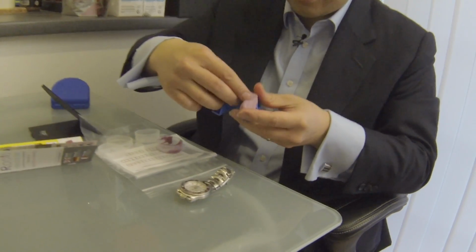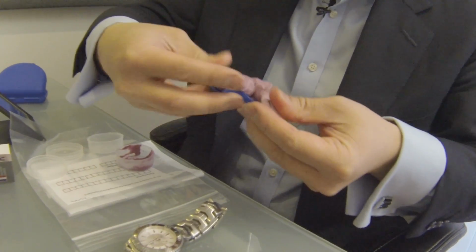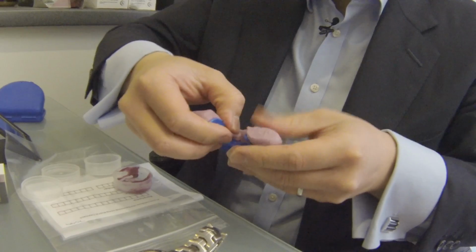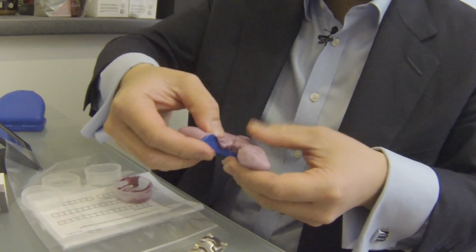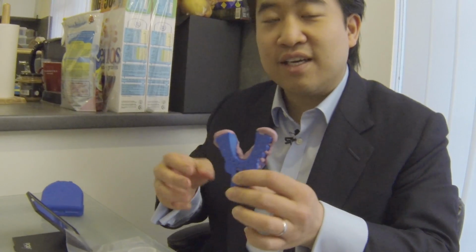I'm going to put this in the tray. So I've made a little sausage. Try and get the coverage quite firmly around. I'm running out of time, so I'm just going to put this in and wish me luck.